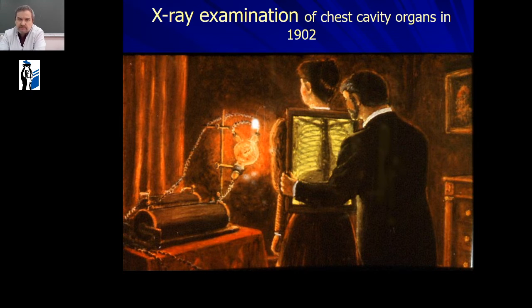Look at this picture. This picture describes X-ray examination of chest cavity organs in 1902. This is very dangerous because there are no anti-X-ray defense.